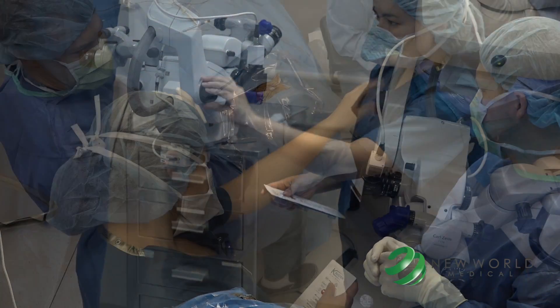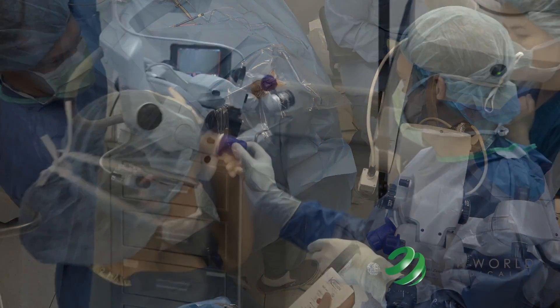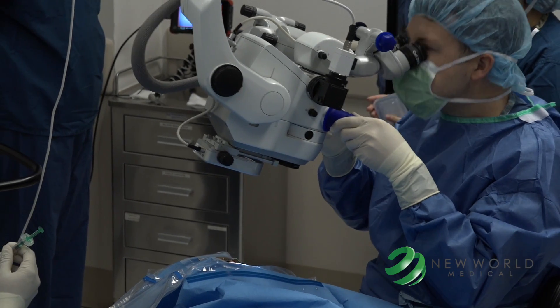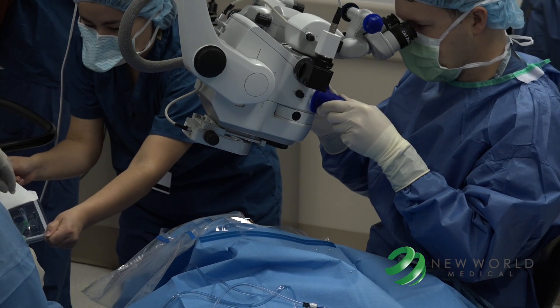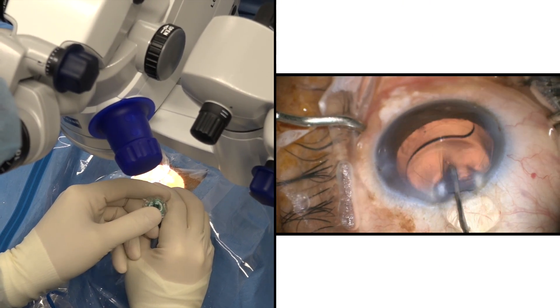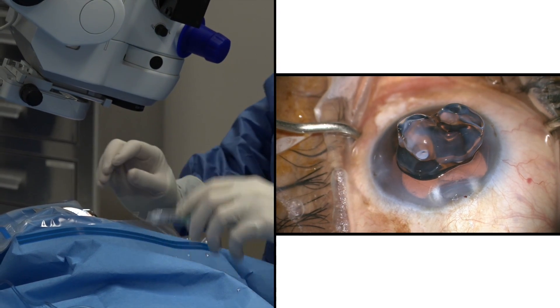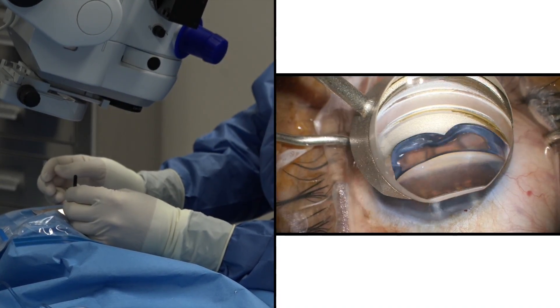I then will focus the microscope on the distal limbus to get those vessels into focus, because I find that when I place the gonio lens the angle structures will be in perfect focus. I use a cohesive viscoelastic both in the anterior chamber and on the surface of the eye — it doesn't really matter which viscoelastic you use, so if you have some leftover dispersive viscoelastic you can use that. You want the chamber filled and that will prevent corneal striae.